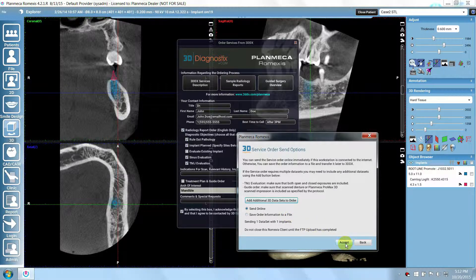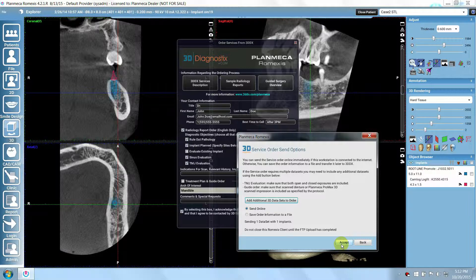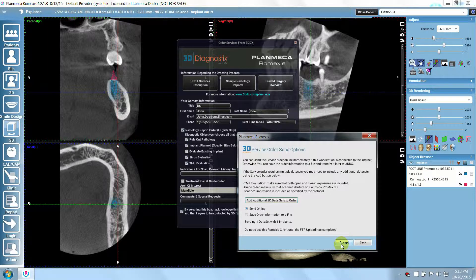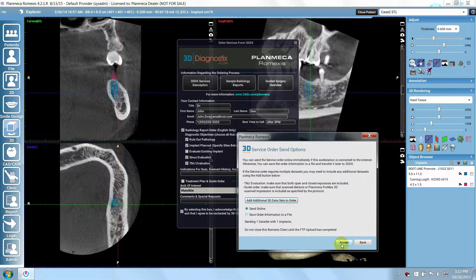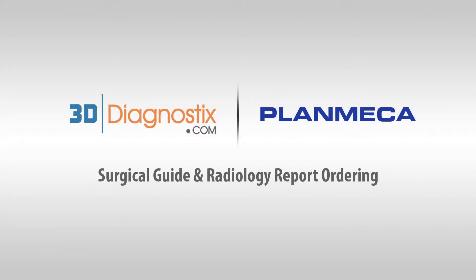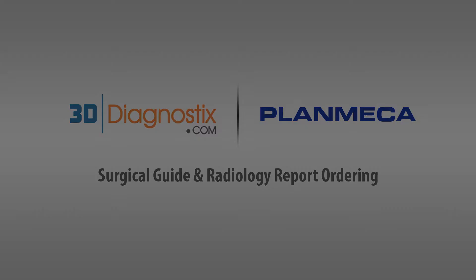The order will now be sent to the 3D Diagnostics FTP site, or saved to your computer. Do not close Romexis until the upload is complete.